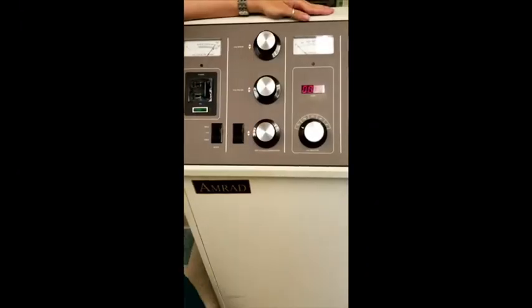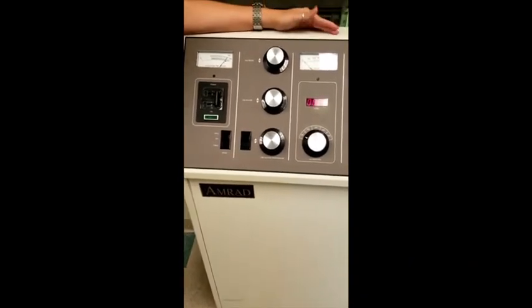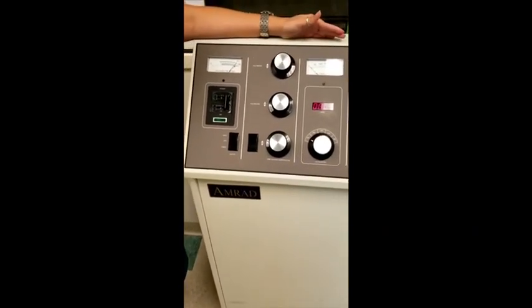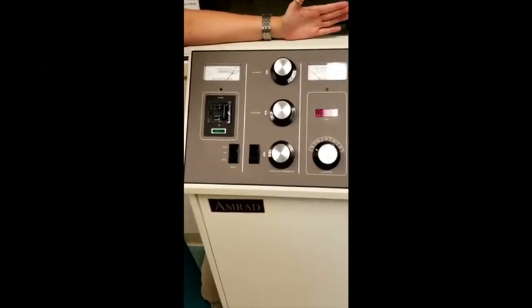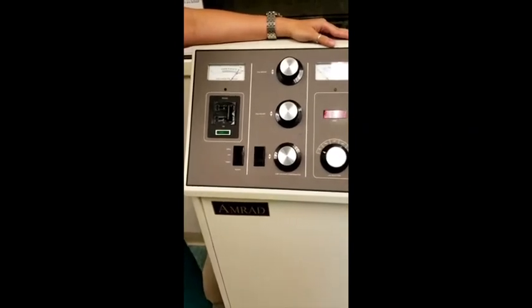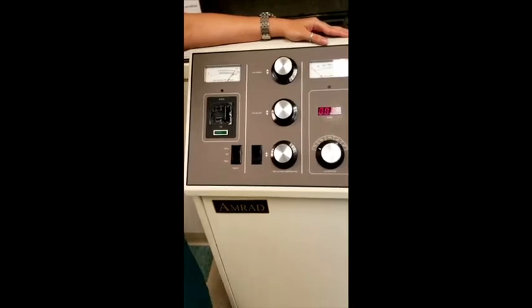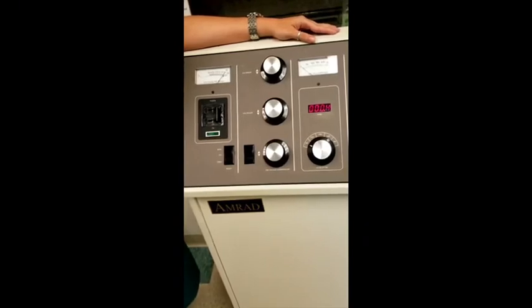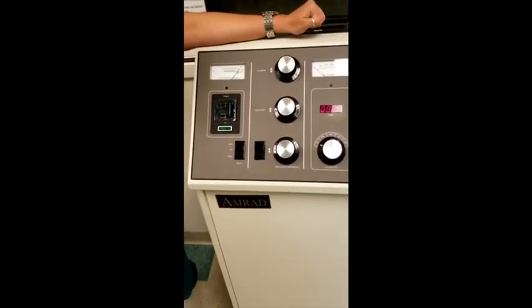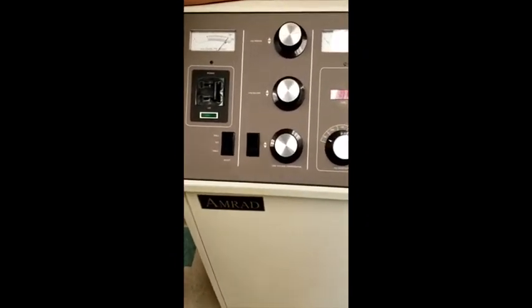The radiographer controls different factors that can help reduce scatter radiation. However, as I previously mentioned, patient thickness is a big factor when it comes to scatter production. When X-raying a thicker patient, a higher kVp is used to ensure sufficient penetration. However, using a higher kVp will produce more scatter radiation. Therefore, to reduce scatter, the radiographer uses the 15% rule to compensate and lower the kVp to reduce scatter and improve image contrast.